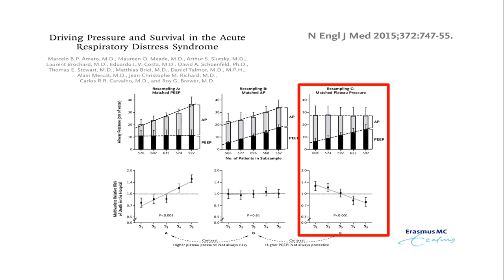And how do we measure the pleural pressures? By esophageal manometer. Yes. So the esophageal manometer at which stage? Inspiratory, expiratory? All measurements are end expiratory. At the end expiratory, an esophageal manometer will closely relate to the pleural pressure. So you can get the difference between the alveolar minus pleural, and that is your plateau minus pleural pressure, that is your transpulmonary pressure.